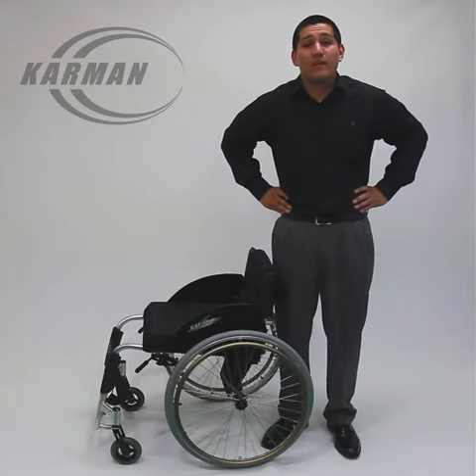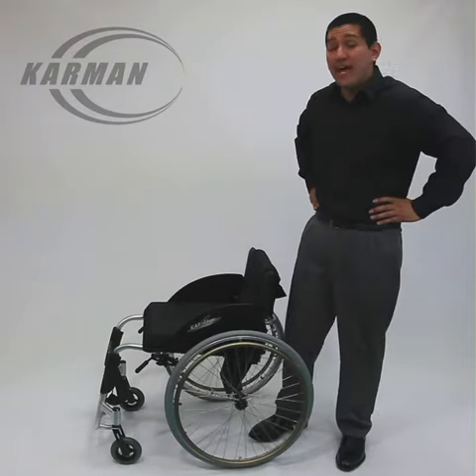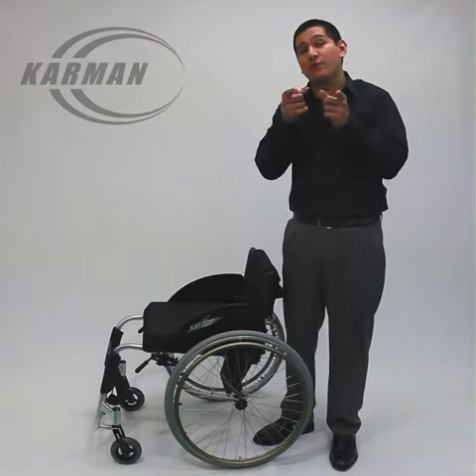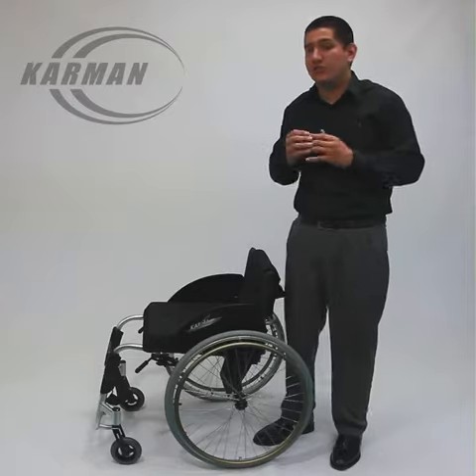Hello everyone, Edward here with Karman Healthcare. Today's part of the video is on our active chair AT60. This active chair is perfect for you — it's custom made just for you.